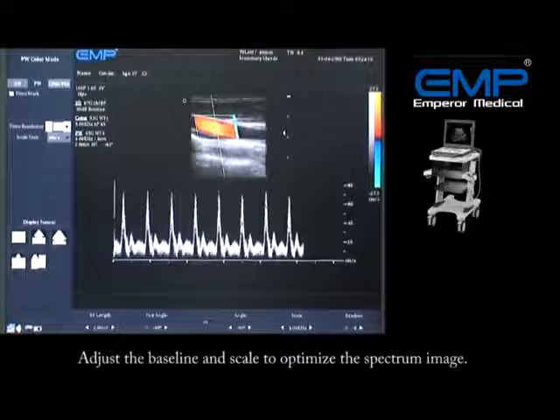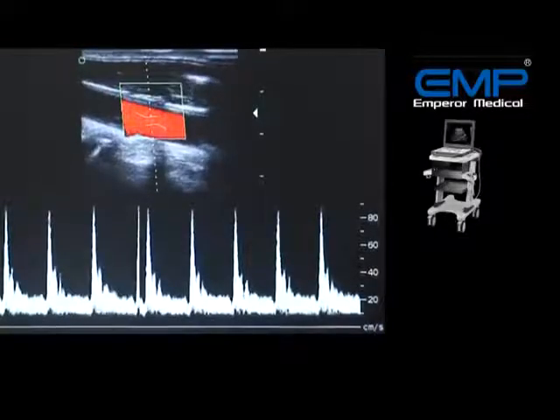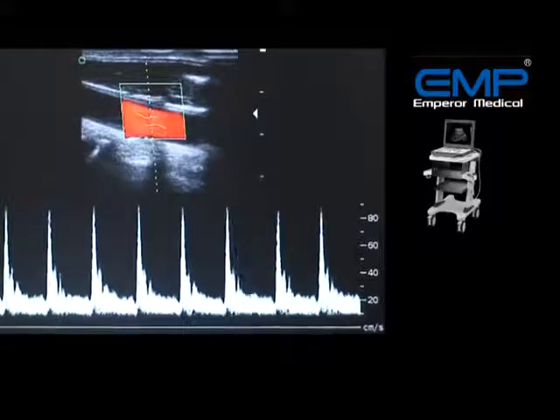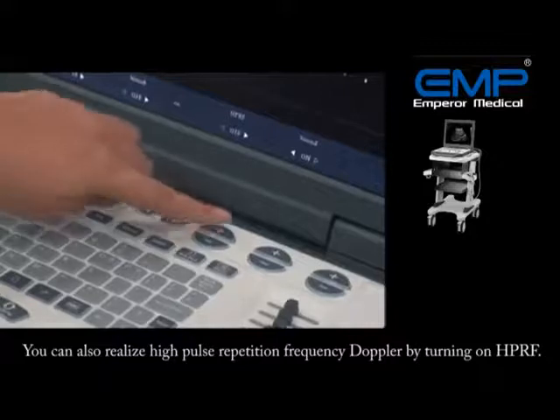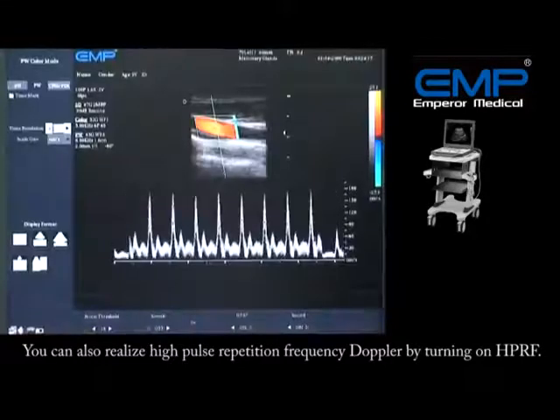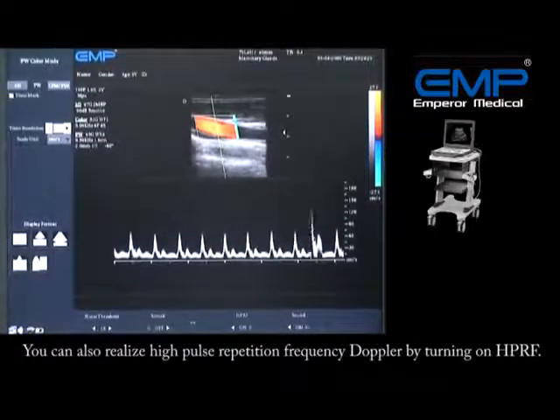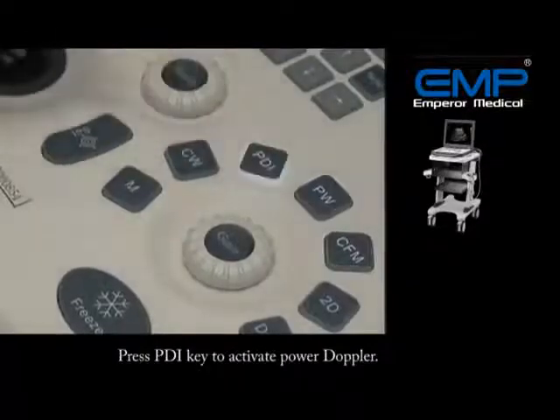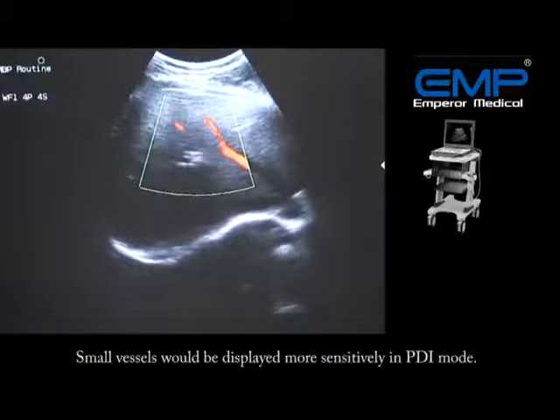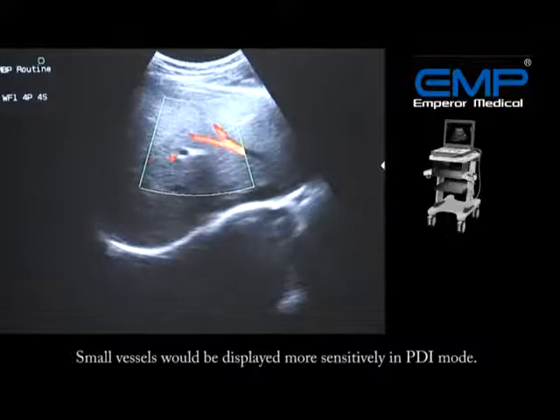You may realize triplex mode by turning on the same mode. You can also enable high pulse repetition frequency Doppler by turning on HPRF. Press the PDI key to activate power Doppler — small vessels will be displayed more sensitively in PDI mode.